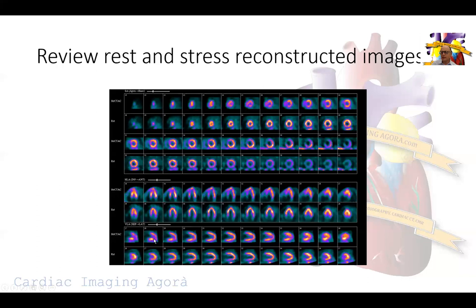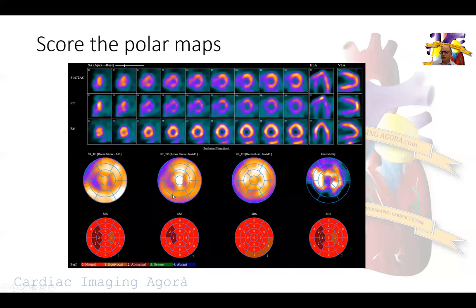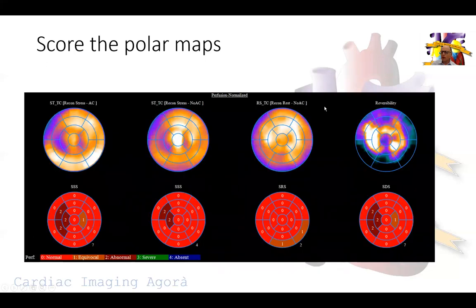When we try to score this it's a complete mess. The rest images are normal, the stress images show perfusion defects with intense uptake in the apex and a septal perfusion defect. When we apply attenuation correction we correct some basal defects but end up with a worse perfusion defect in the septum. The reversibility map shows a large area of reversibility with a weird shape of the heart.